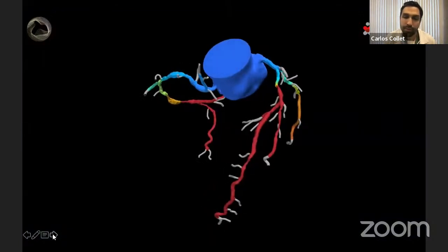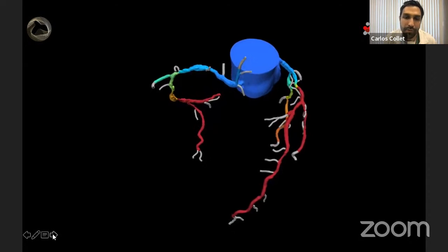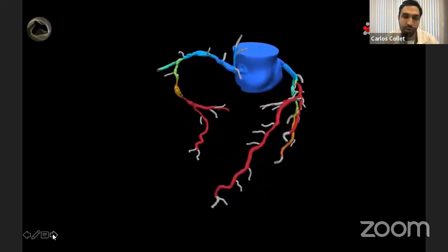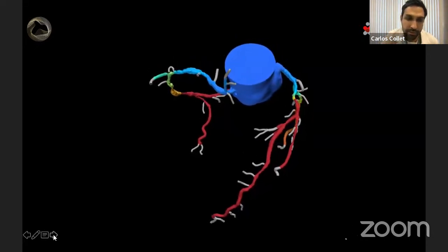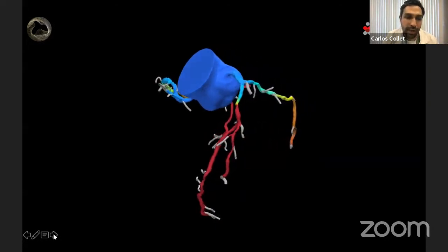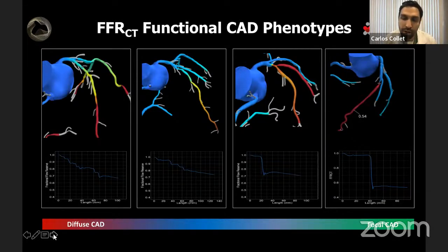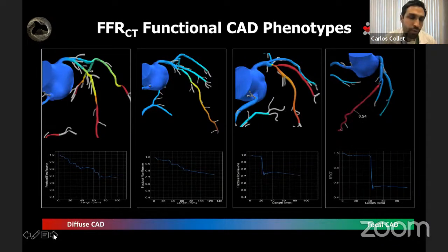We're talking about focal and diffuse disease. In a typical case of three-vessel disease, you see in the FFR CT model that everything is blue when the FFR is very high, and it becomes red after the lesions, meaning the FFR is significant. Beyond characterizing lesions as significant or not, we can derive from FFR CT the pattern of CAD. You can see more focal lesions with a clear pressure step-up at the level of the lesion, and on the opposite end, diffuse coronary artery disease with no clear target for PCI and a diffuse pressure loss.